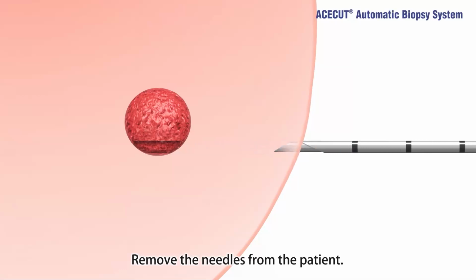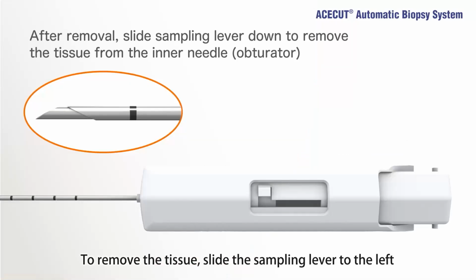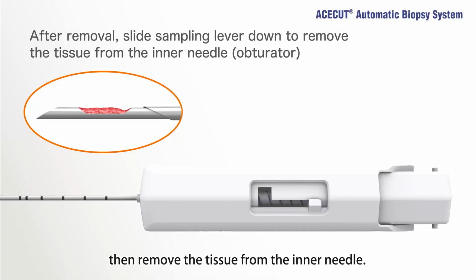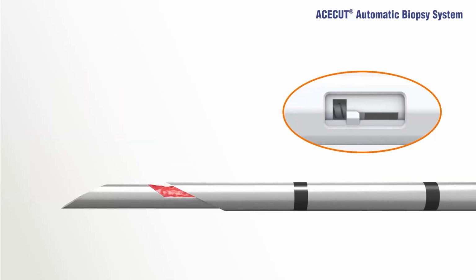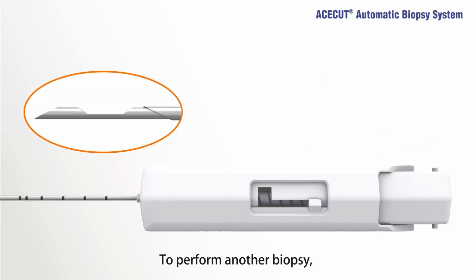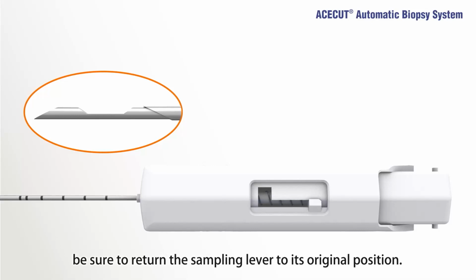Remove the needles from the patient. To remove the tissue, slide the sampling lever to the left and then down to expose the inner needle. Then remove the tissue from the inner needle. To perform another biopsy, be sure to return the sampling lever to its original position.